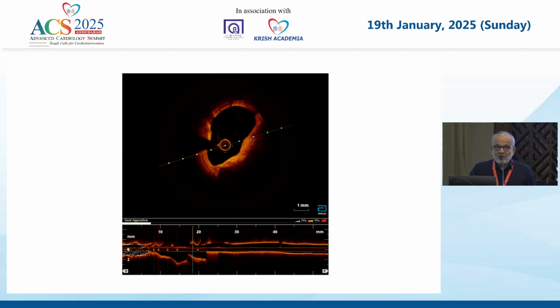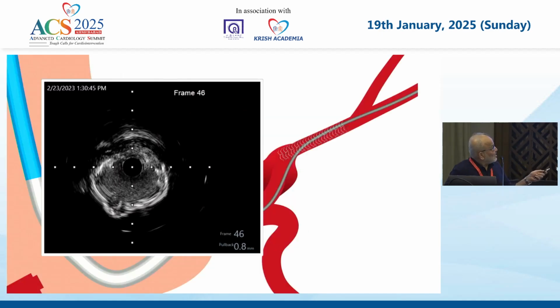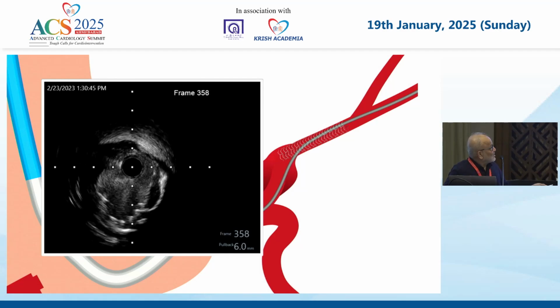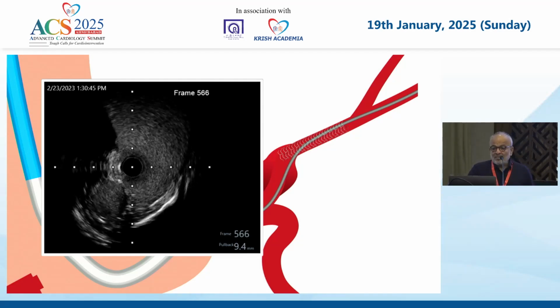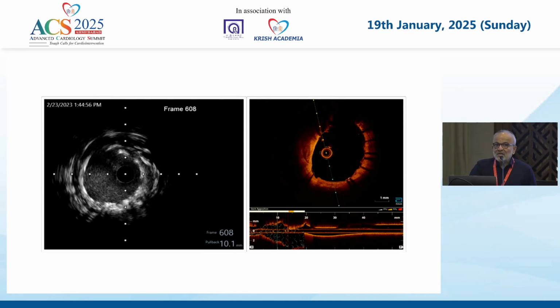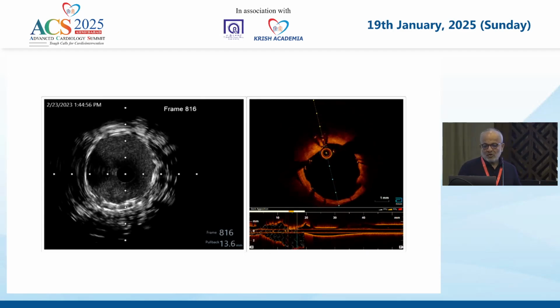There was an aneurysm which happened at that point of time in the proximal edge of the stent. We confirmed it even with IVUS here. This is a true lumen. And now suddenly you see the shift of the shaft into a different cavity. And this is the original cavity. And then again coming, you can see the left main. So this happened. And these are the still pictures which clearly show the lumen, the aneurysm, the shaft going through, and then the correction was given, and this was a perfect picture. So these are the problems you can identify. Otherwise, without imaging, you remain clueless and you don't know what you are doing.